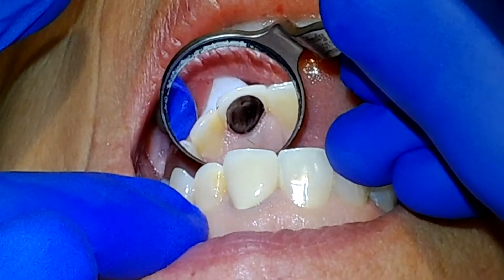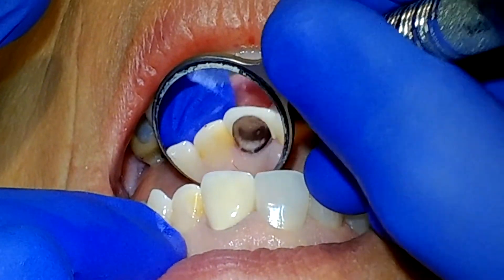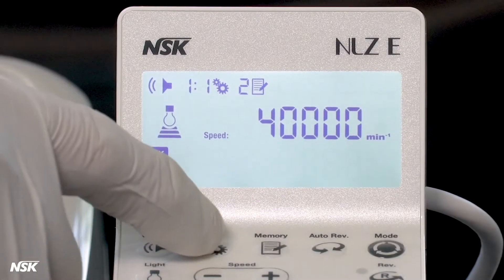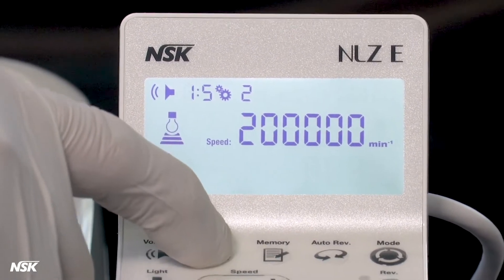In our first clinical scenario, our patient presented with a 40-year-old metal ceramic crown that she wanted replaced for cosmetic reasons. On your NLZ touch panel, the best setting for cutting off metal ceramic crowns is going to be 200,000 RPMs.